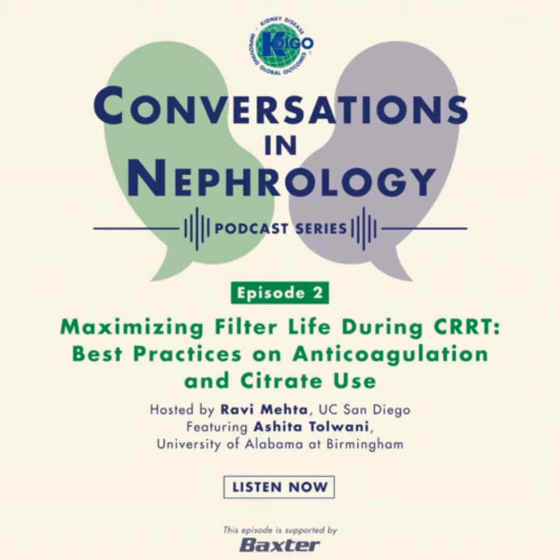But even if you have a circuit patent, that doesn't mean that you're actually delivering the proper dose of therapy, because we know over time the filter permeability decreases, and this decreases the diffusive or convective loss of solutes through that filter. Essentially, it decreases your solute delivery, or I should say dose. Given that, I recommend that anticoagulation should be used for that purpose.